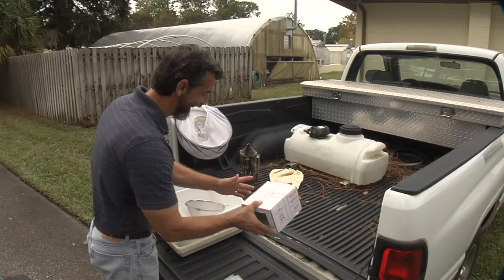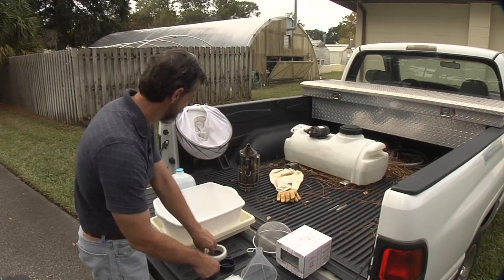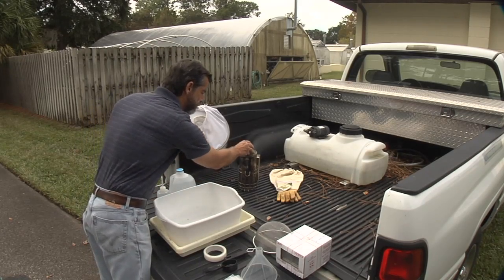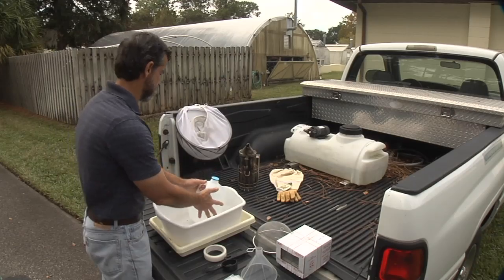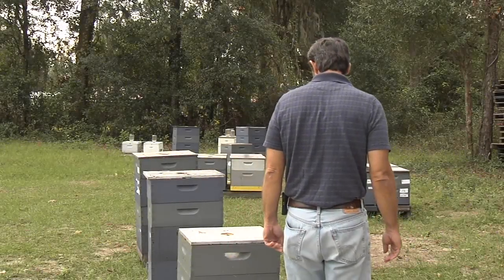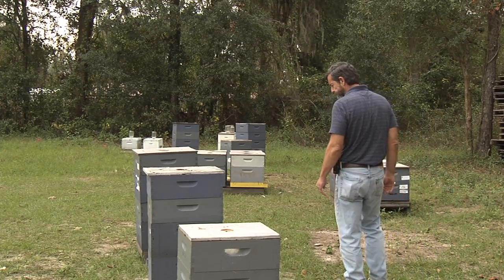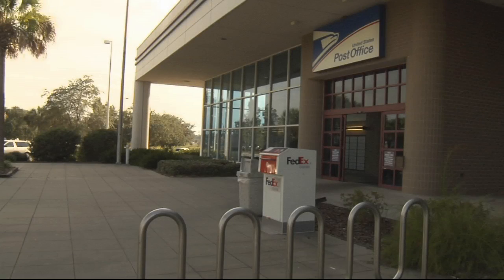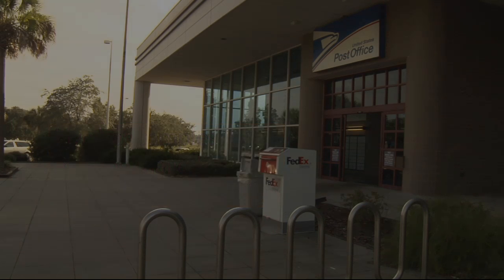Before leaving for the apiary, ensure you have all of the necessary equipment including beekeeping protective gear and beekeeping tools. It is also important to remember to fill the one gallon bottle and the wash bottle with water. Identify an apiary with at least eight colonies of bees, and identify the nearest post office to this apiary. You will need to mail the live sample as soon as possible — it is important that live bee samples be mailed on the day of collection.